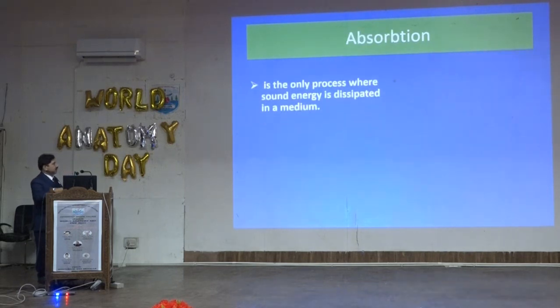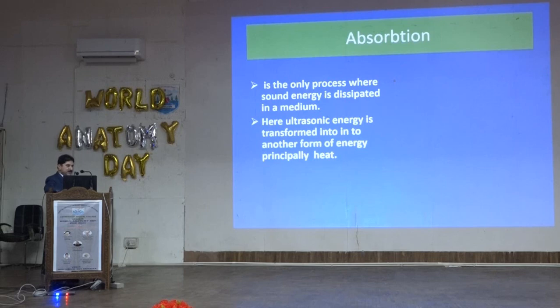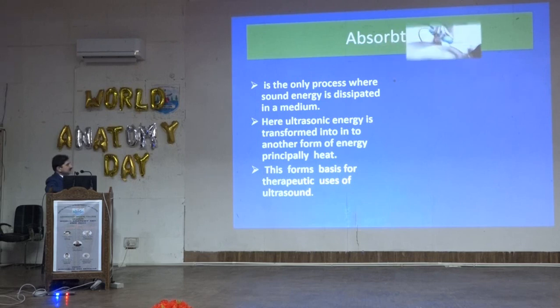Now another way the tissues of the body behave with ultrasound waves is absorption. It's the only process where sound energy is dissipated in a medium. Here the ultrasound energy is transformed into another form of energy, principally heat. This is the basis for the therapeutic use of ultrasound.